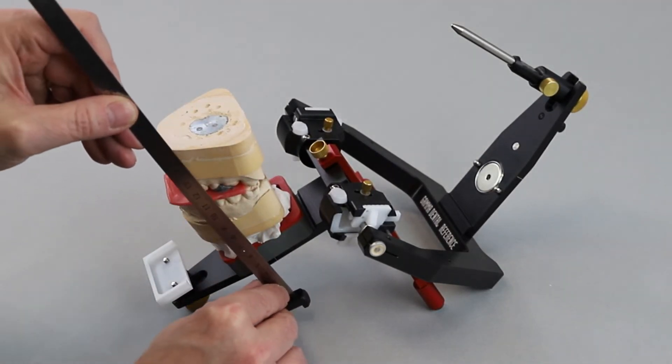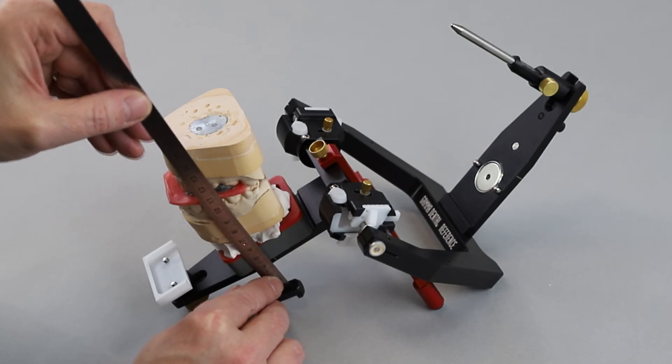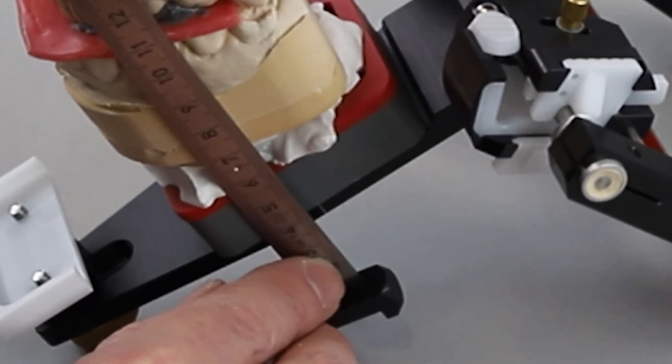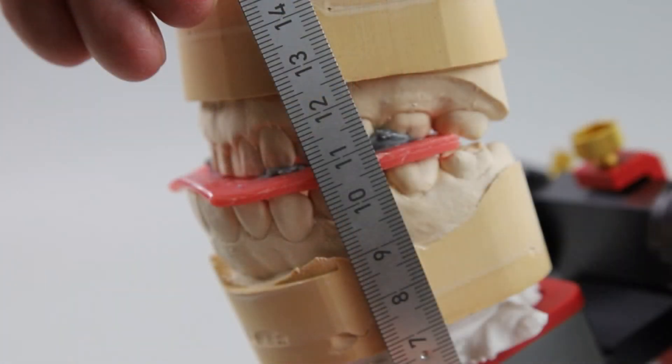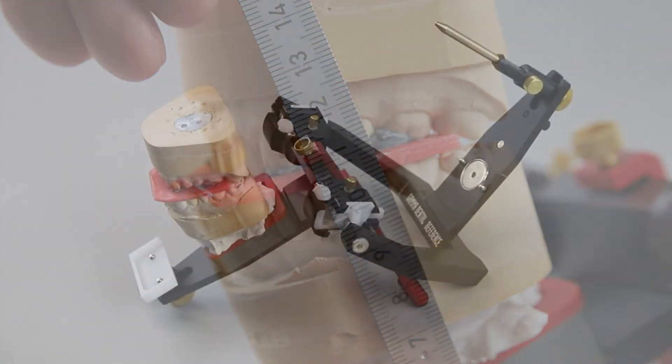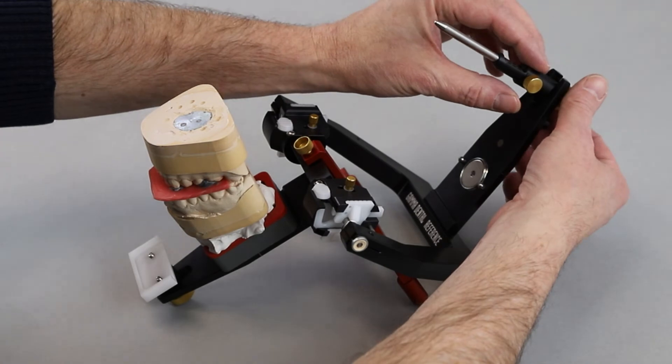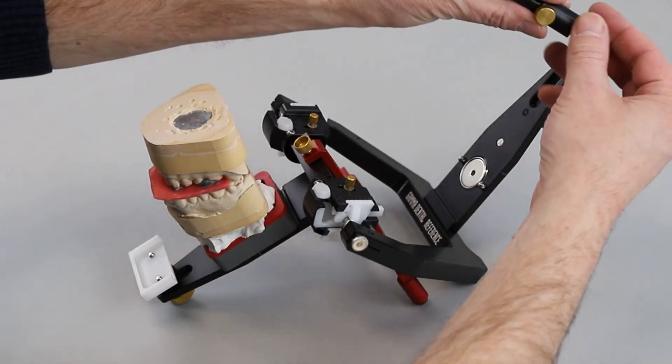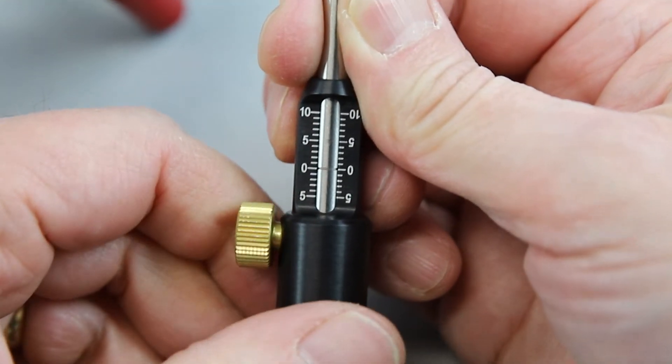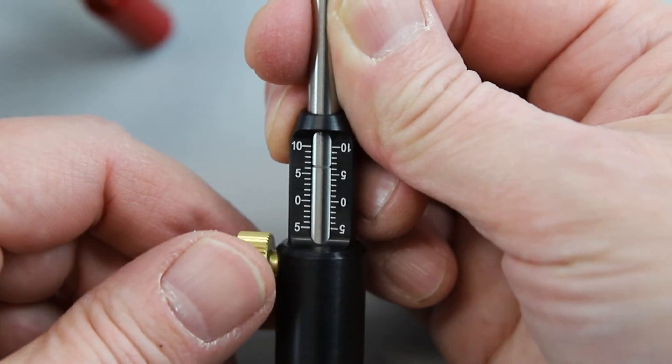Measure how far the bite is blocked by the bite registration in the area of the center mark of the articulator. The incisal pin must be pulled out to twice the amount indicated, starting at the zero line.